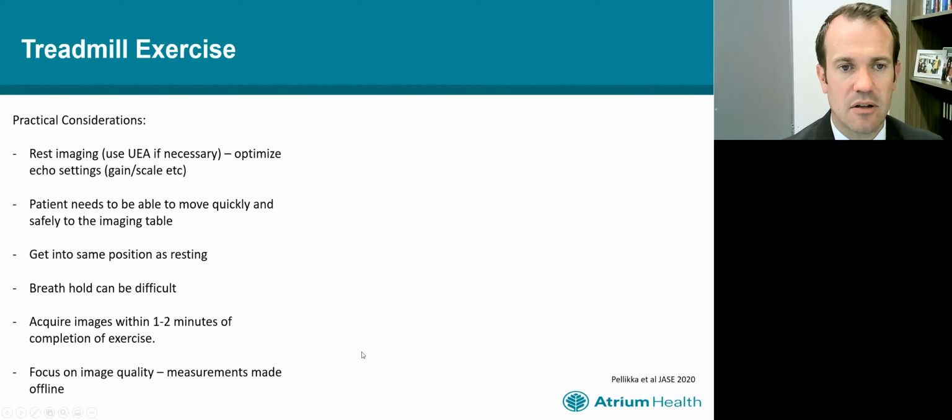So some practical considerations for treadmill exercise. We need to really get some very good resting images, recognize if we need to use ultrasound enhancing agents if we're not seeing the endocardium very well. We need to be able to have a patient who can move quickly from the treadmill to the imaging table.